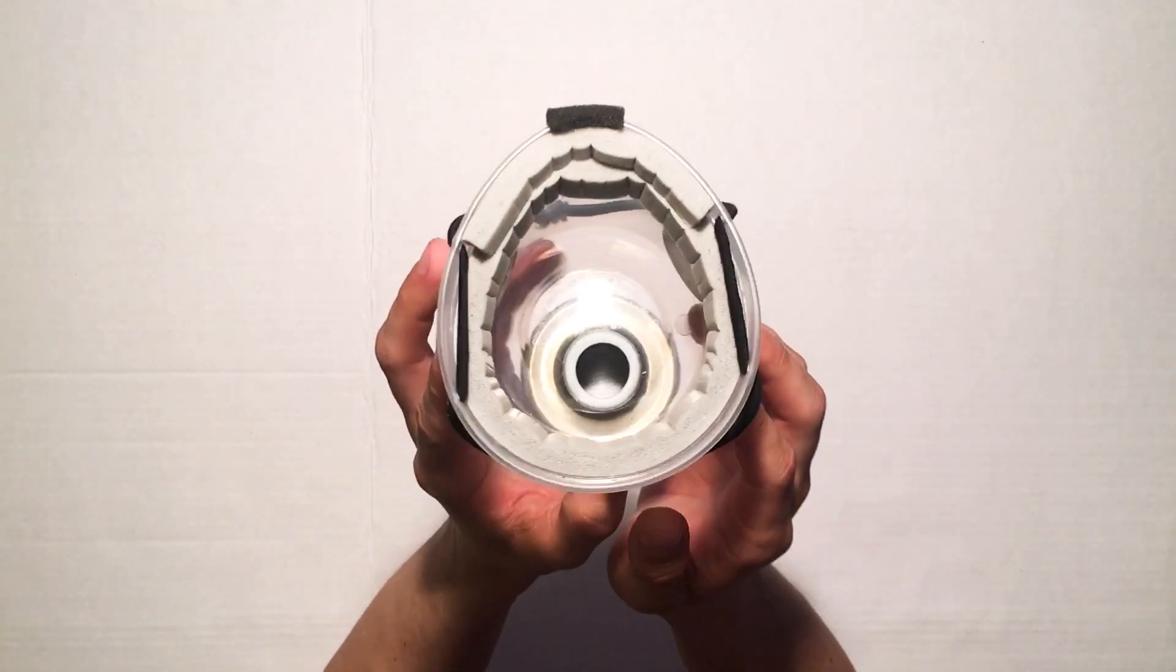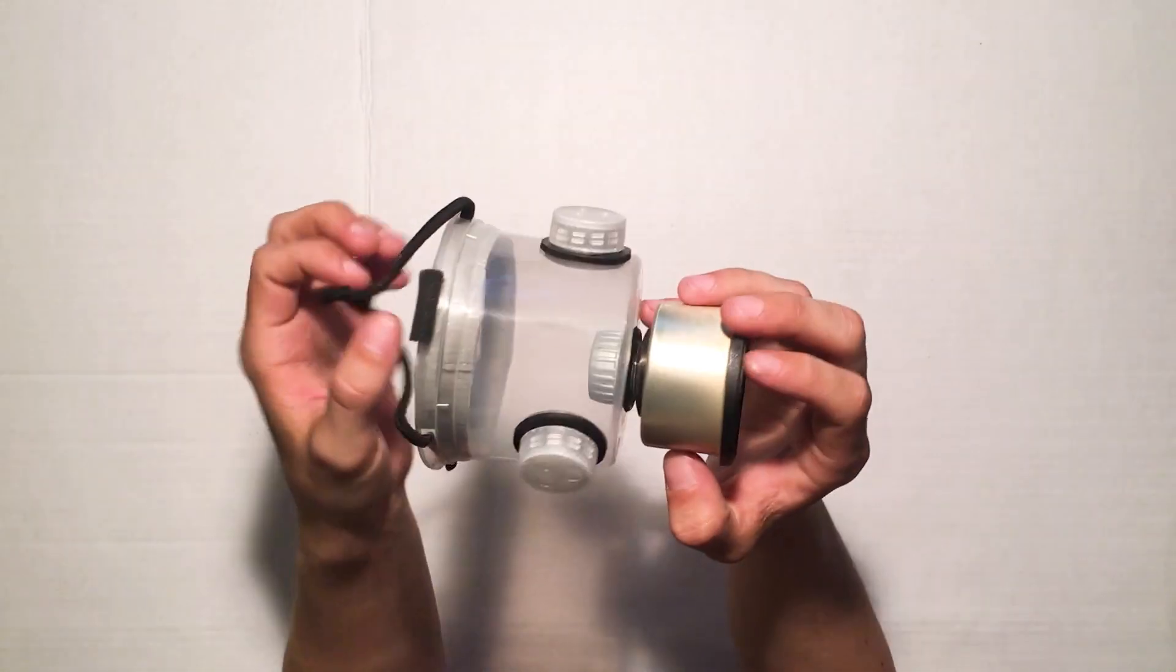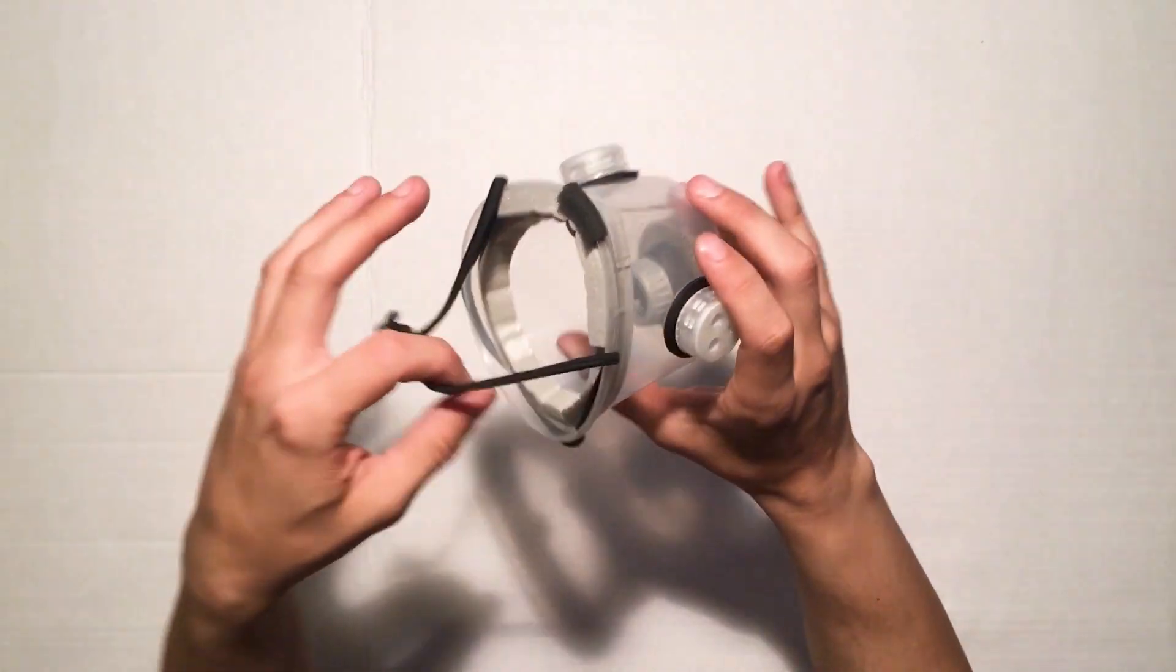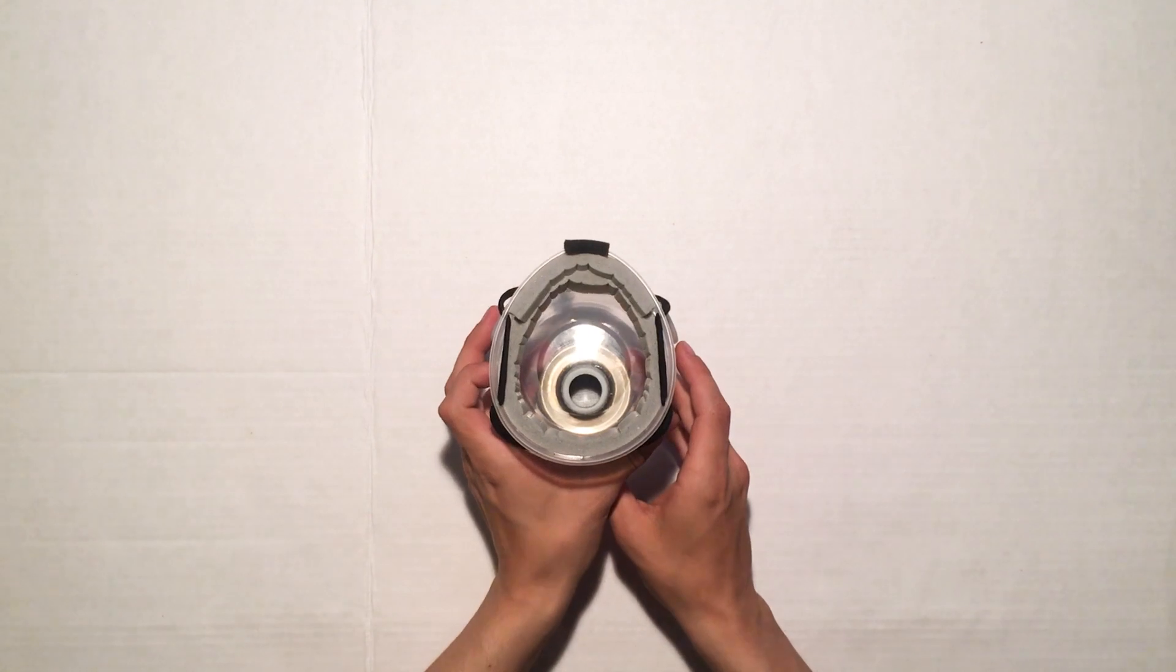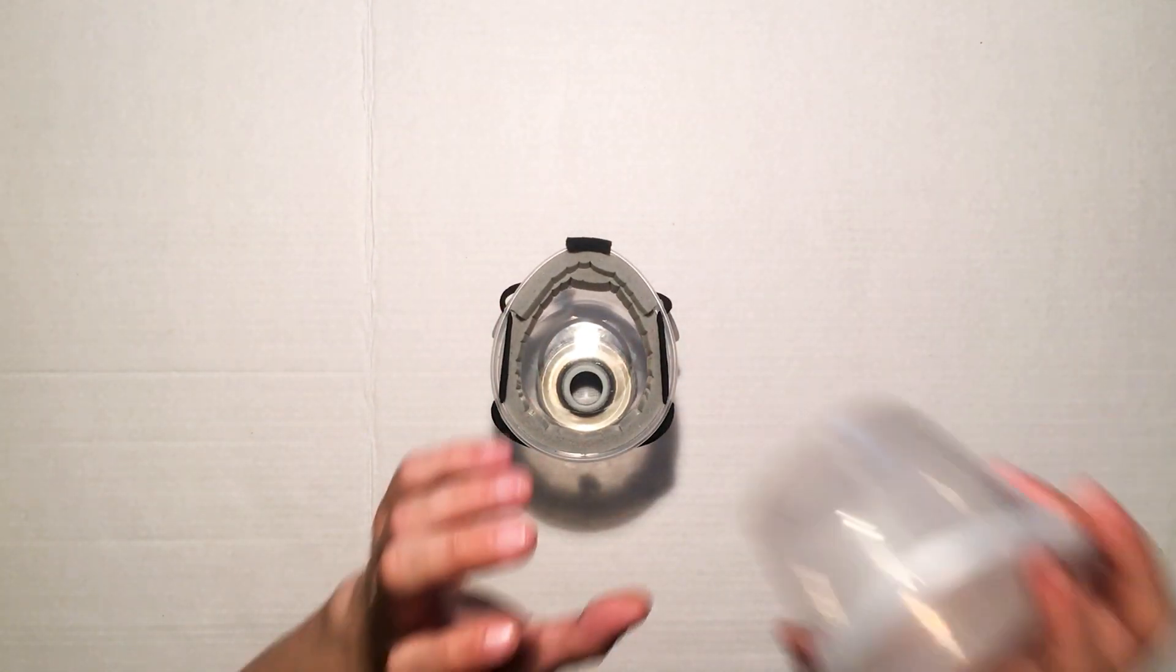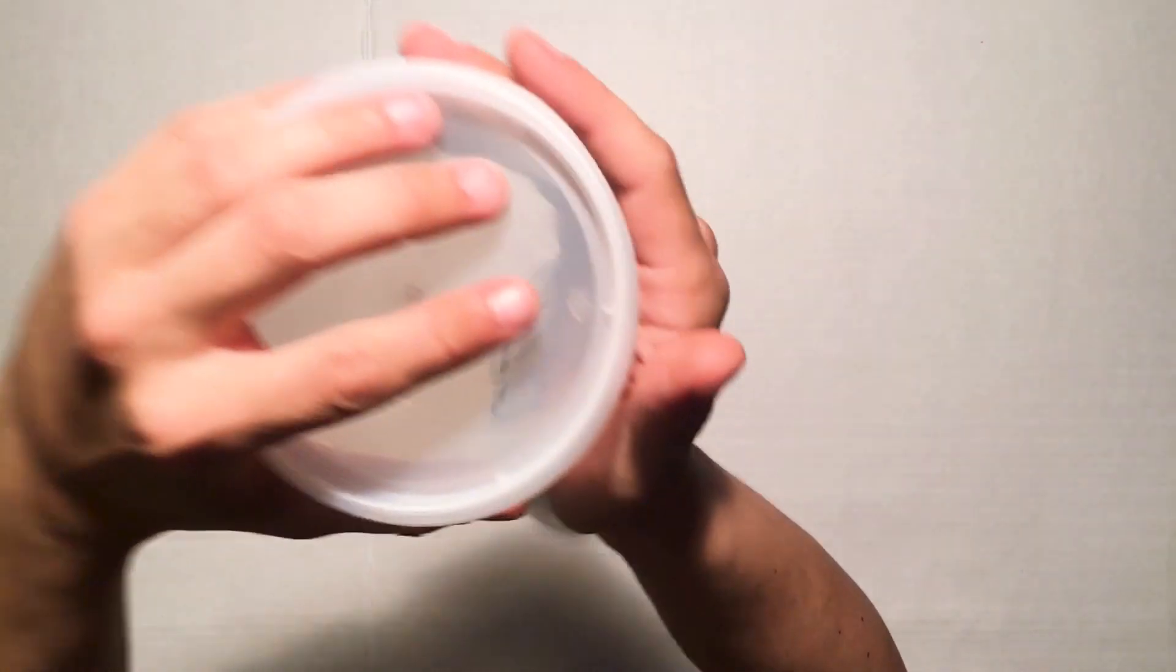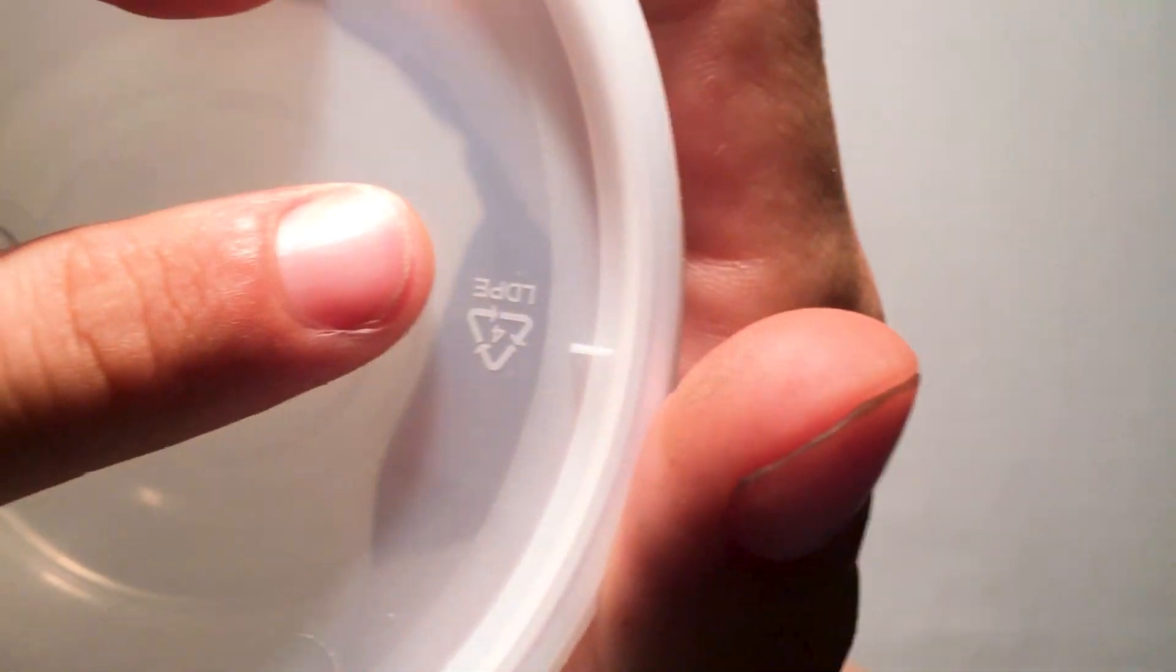Examining the build, you'll see this is a fairly simple construction. The face piece is made from a 16-ounce deli container. These are made from number 4 LDPE plastic.